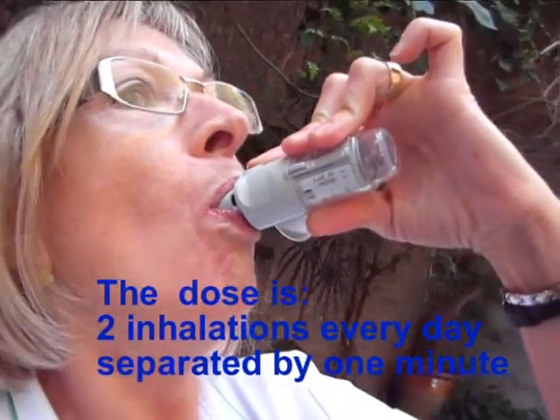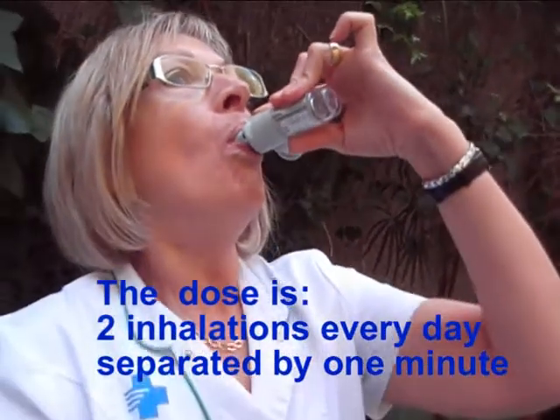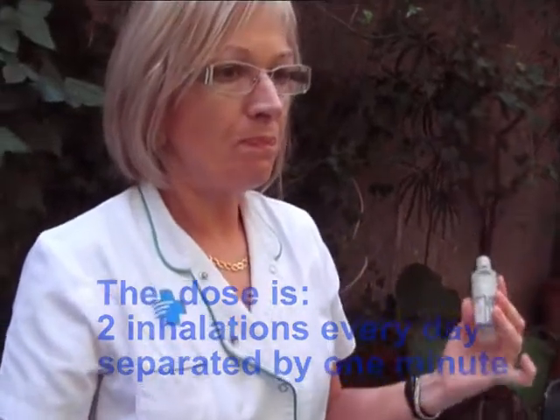The dose is two inhalations separated by one minute. Finally, rinse out your mouth with water.